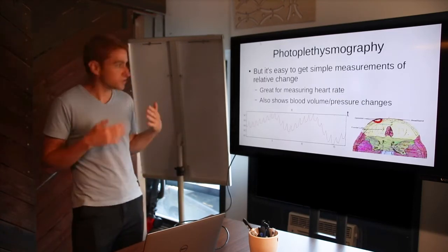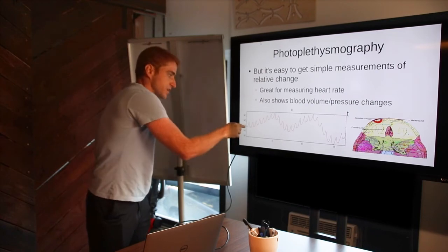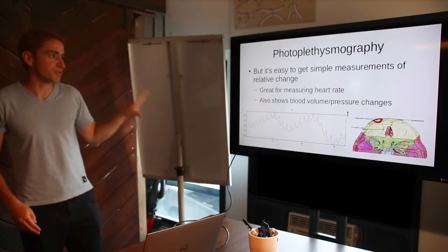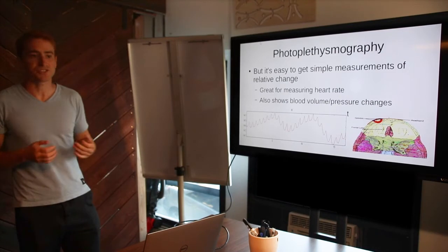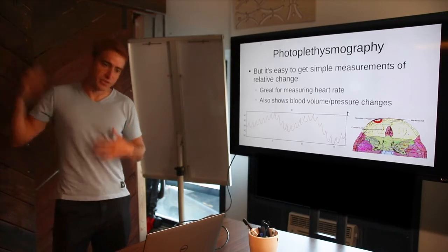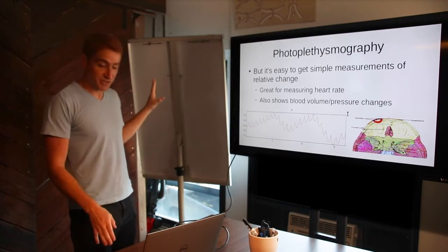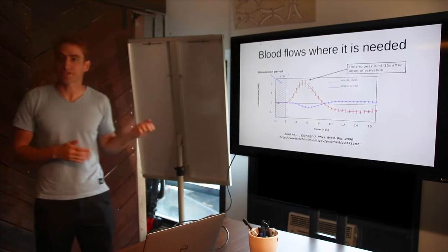When we do this, we get 2 components to the signal. One component is just this kind of waveform, which this is about 5 seconds, 10 seconds. So each one of these spikes is a heartbeat. So you can see your heartbeat very clearly. We also get a longer-term oscillation, which is called the Meyer wave. This is a breathing-related waveform, but it's actually not breathing itself that's causing the change. It's actually the pumping action of your lungs and the autonomic nervous system acting to redirect blood from your lungs to your brain when you're exhaling, and then back to your lungs when you're inhaling, so that you maximize the efficiency of your lungs. So this technology, when you're just doing a single wavelength, it's called photoplethysmography. It's basically the optical measurement of volume. But what we do is we go farther than that. We're actually measuring the oxygenation.